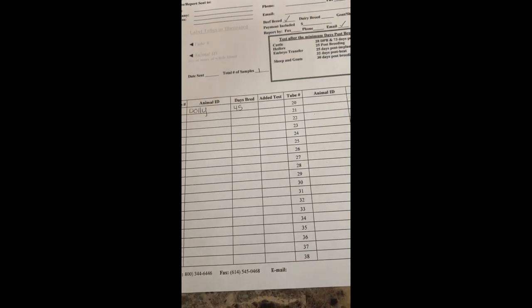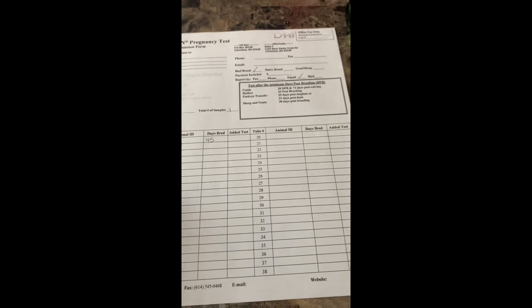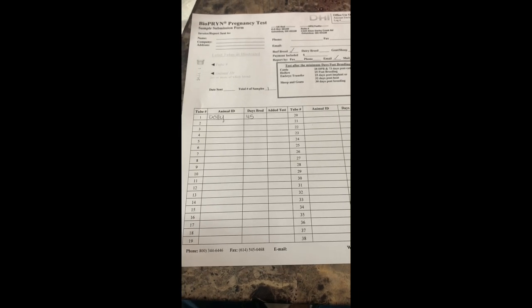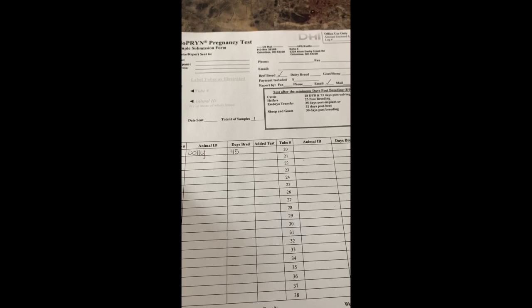That's way cheaper than calling the vet out. So if you're comfortable doing the blood draws, I highly recommend it — it's super easy, don't be intimidated by it at all. You can do up to 100 at a time, but we are just doing one today. I'll go ahead and get this filled out and then I'll show you how you package the blood as well.